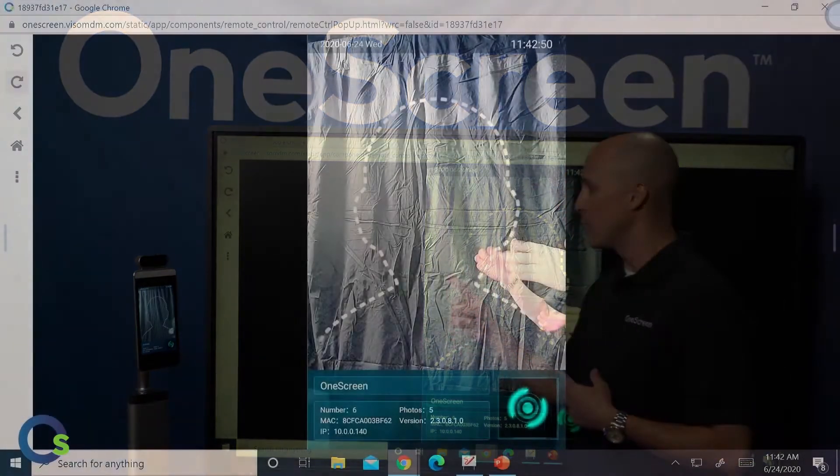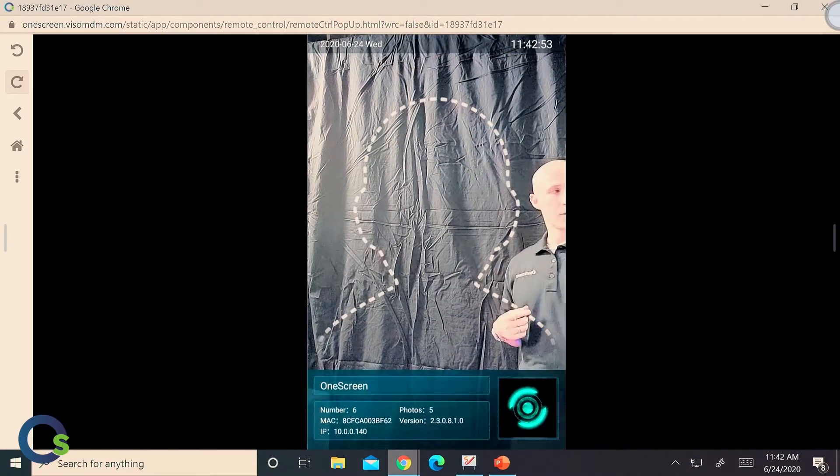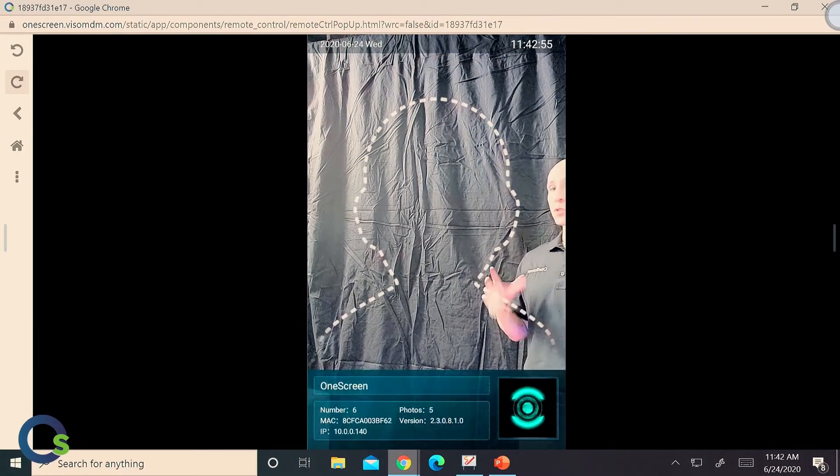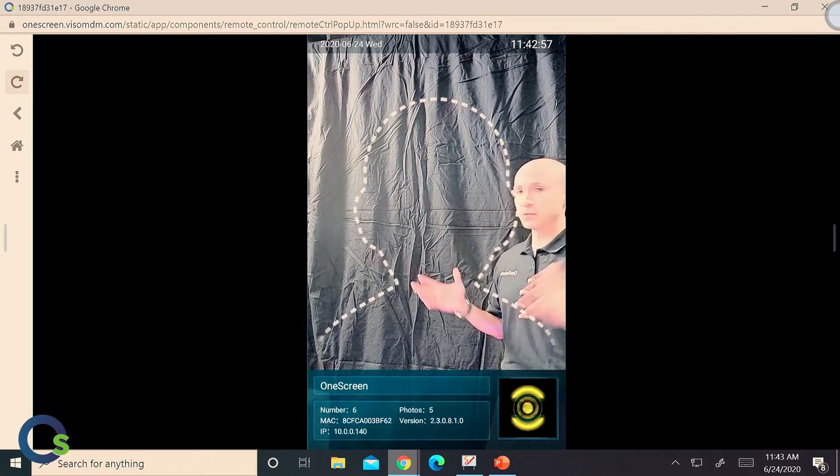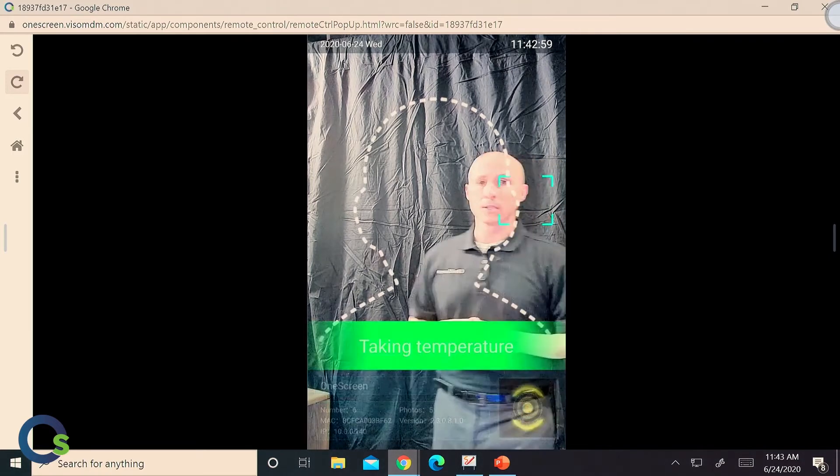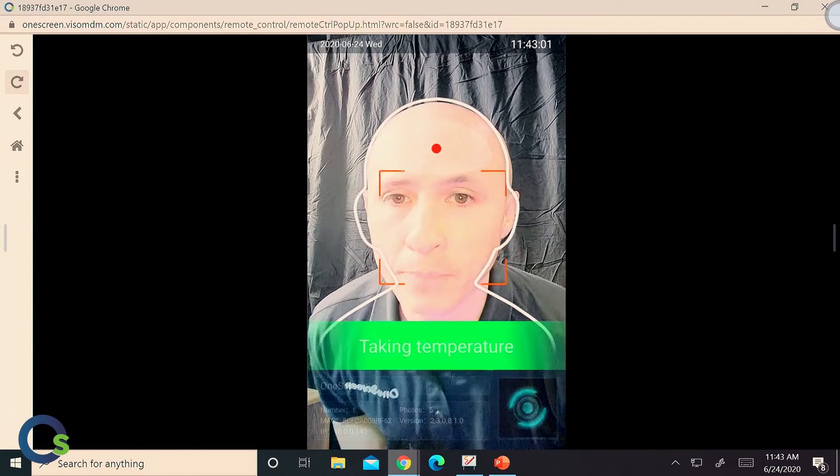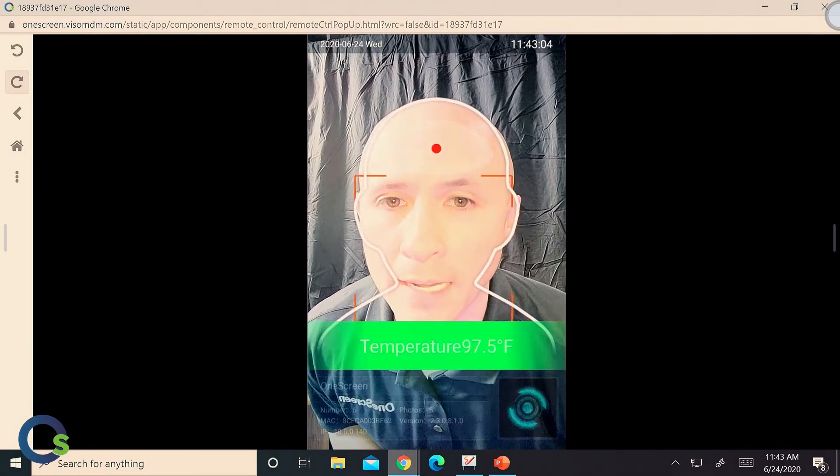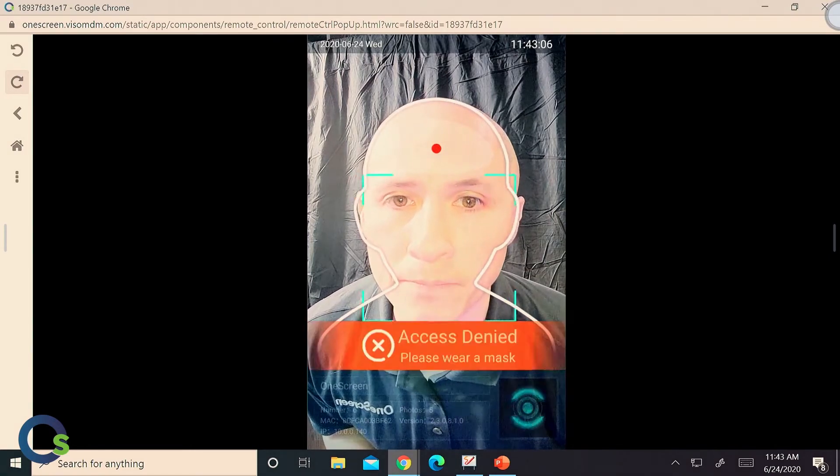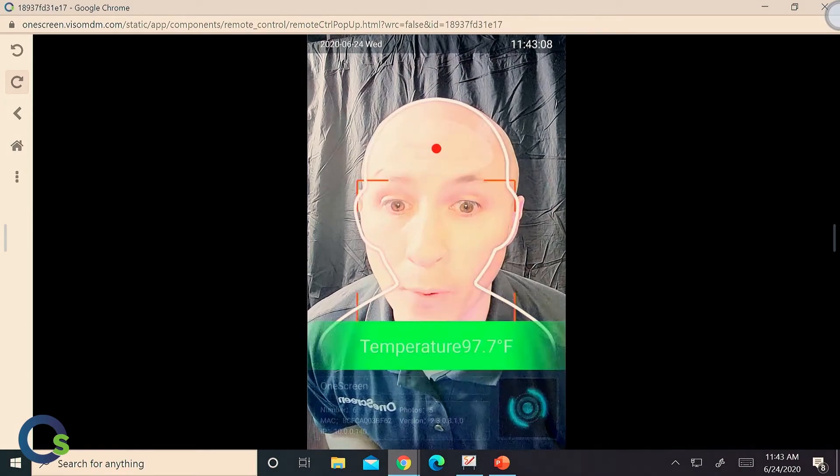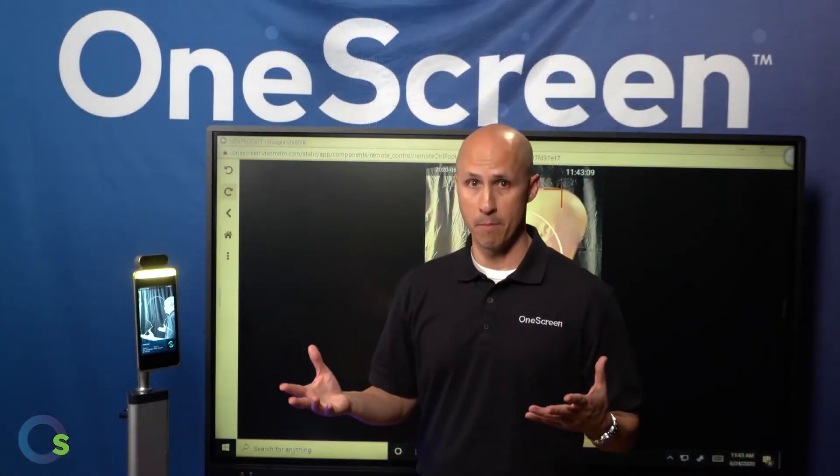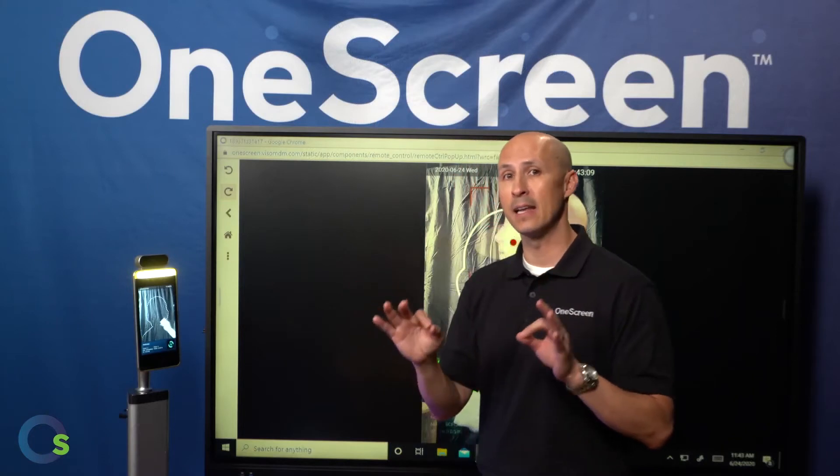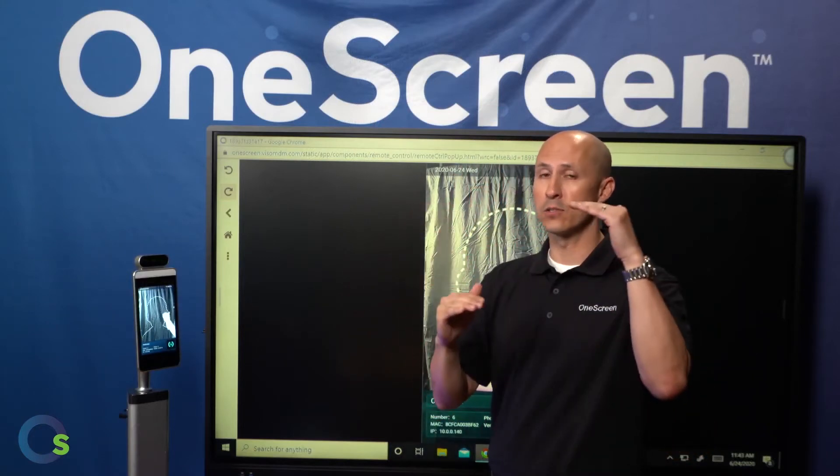Now, what you will notice is there's a nice little white outline that you're supposed to put your face into. Oddly enough, shaped just like my head. Now, as I walk into the device, there's going to be a red dot. You want to place that right in the middle of your forehead and as it takes your temperature, it's also going to then, at this point, deny me access. Why, you ask? It's because I was not wearing a mask. We happen to have that setting clicked on.